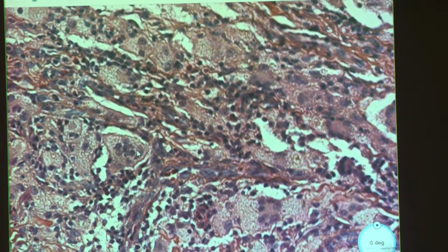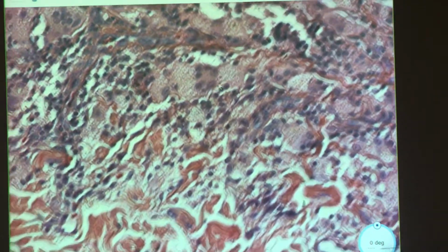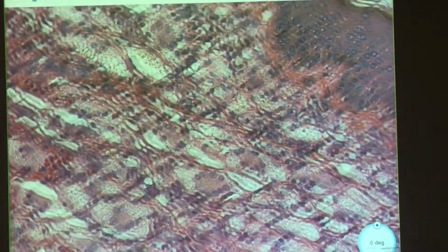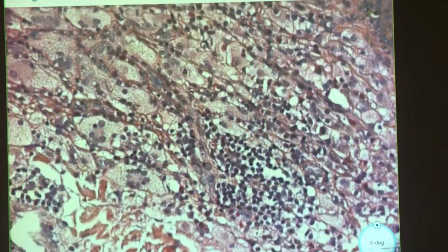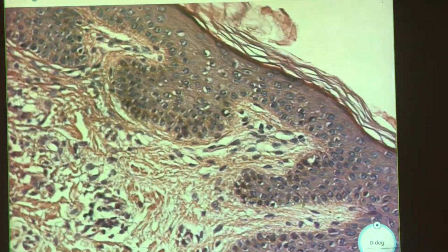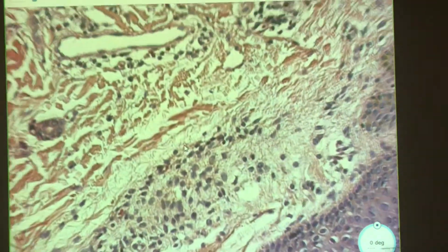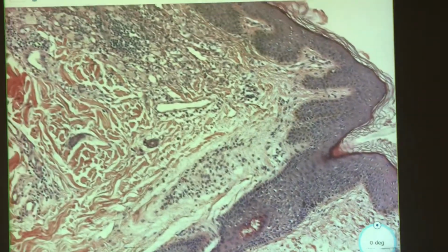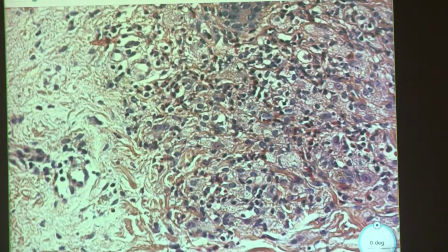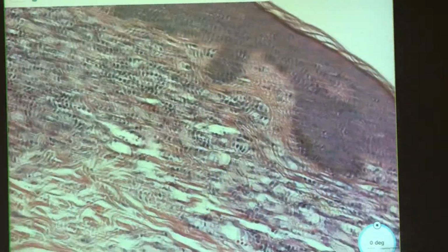There's some. Ooh, is that a giant cell? I think that might be a giant cell. And then it looks like there's another one that you just passed over. Your mouse was almost on it. There's another one. Once you see one, you can't stop. Once you pop, you can't stop, right? I think that's Pringles, isn't it? Oh, you might be right. Lay's is, but you can't eat just one. For anyone who doesn't know, those are potato chip slogans and companies here in North America. We are very brainwashed. Yes, we love our junk food because it is delicious and terrible for you.